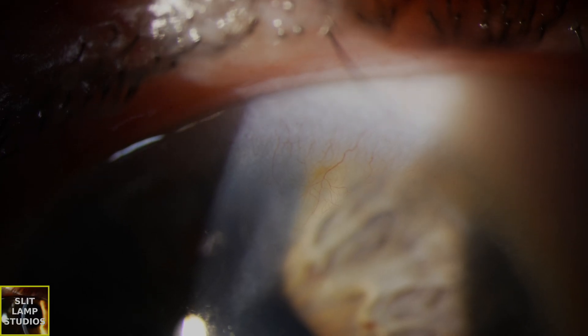So if you have vascularization, inflammation, as we can see here, we know it's active because we can see those individual red blood cells moving through the blood vessels.